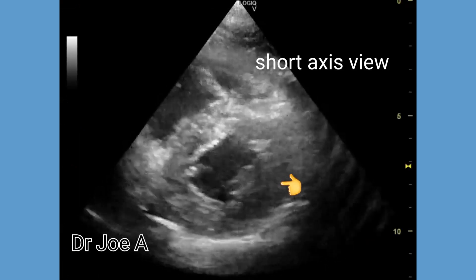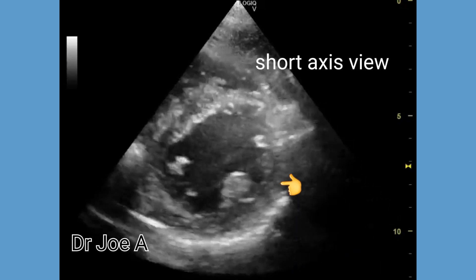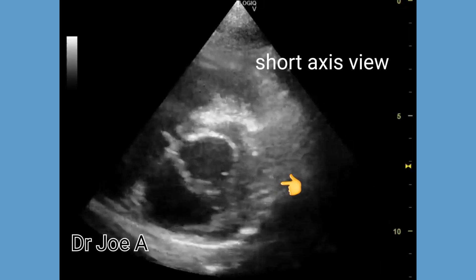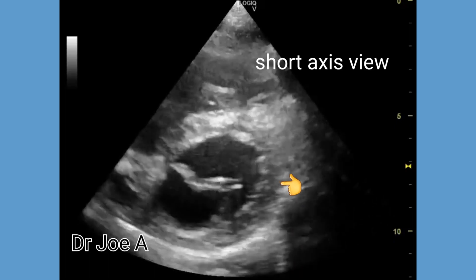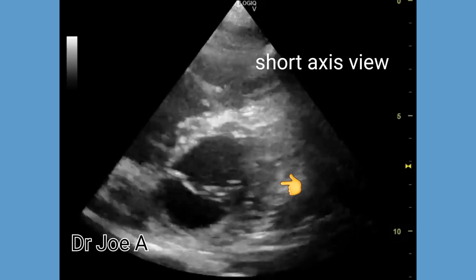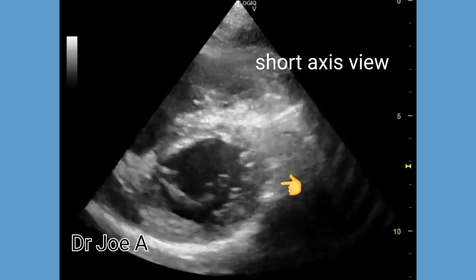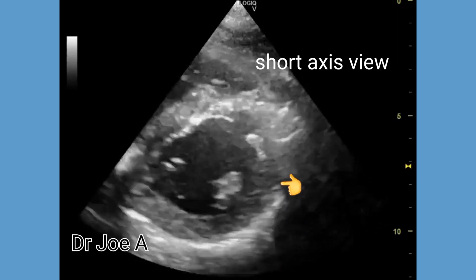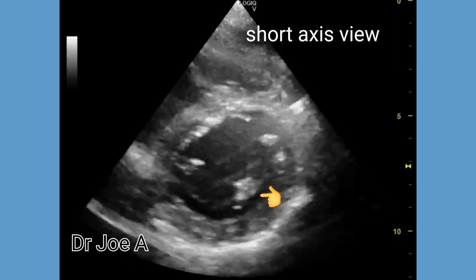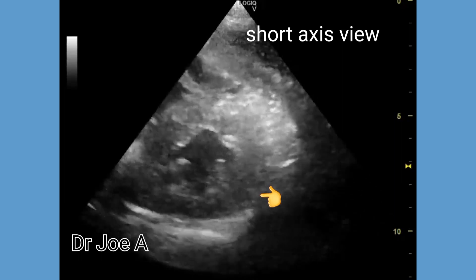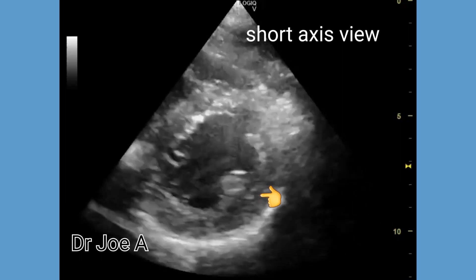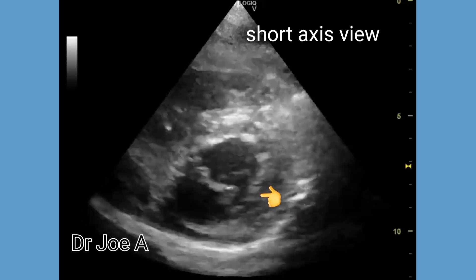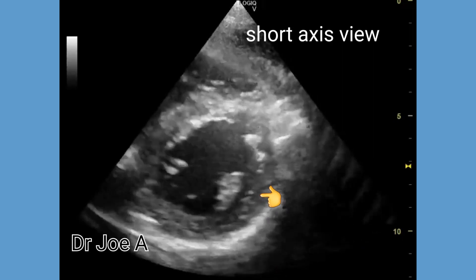In this short axis view, we see that only the papillary muscle is hypertrophied, but the left ventricular wall itself is spared. MRI imaging may be required to confirm the diagnosis. Studies suggest that papillary muscle hypertrophy may signify a partial failure of the valve mechanism.